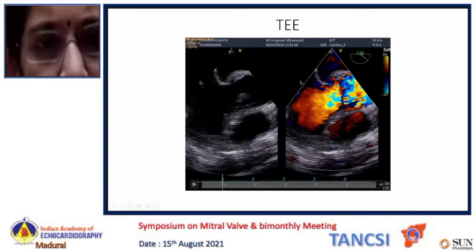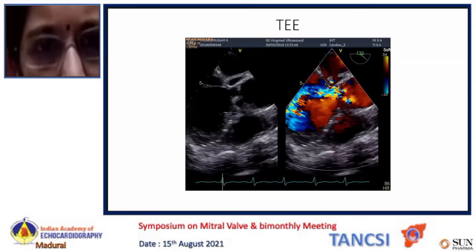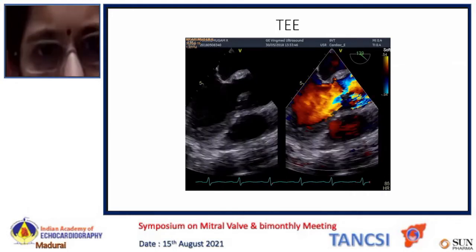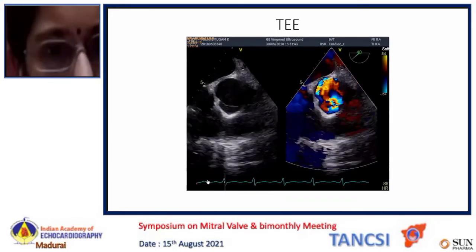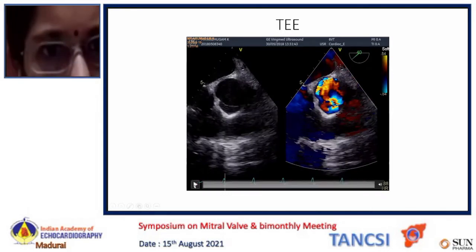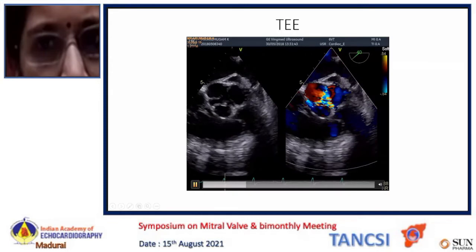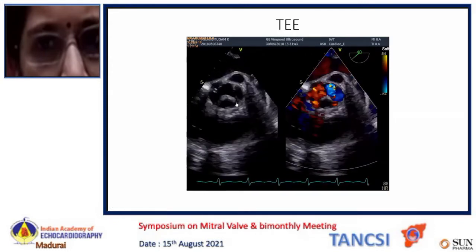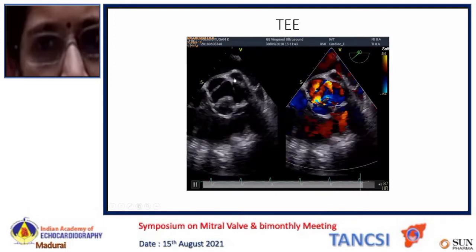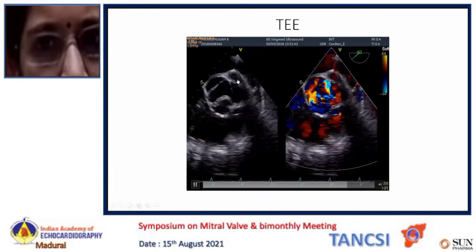The Doppler color flow across the aortic valve showed significant eccentric severe aortic regurgitation. It was a tricuspid aortic valve with the hyperechogenic mass attached to the RCC and a cystic lesion which was inferior to the LCC towards the LA, probably suspected aortic root abscess.